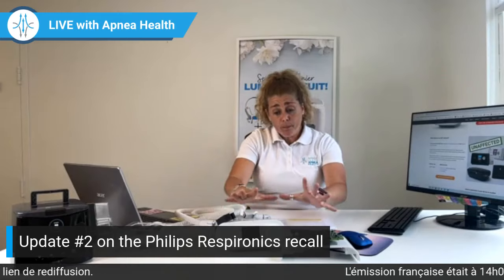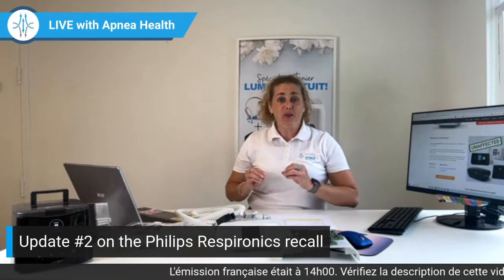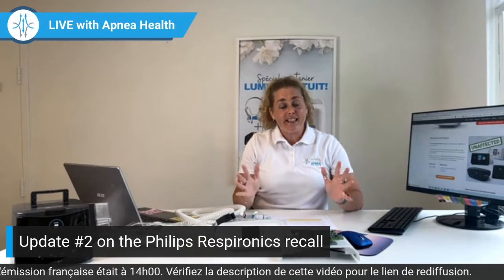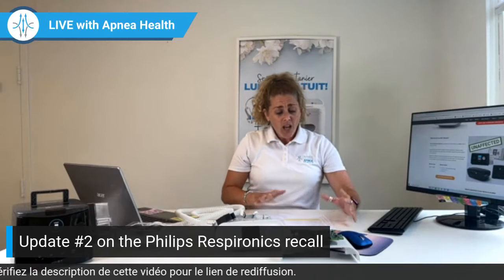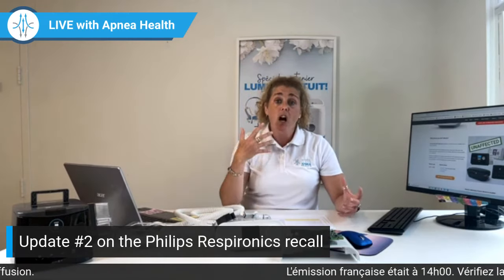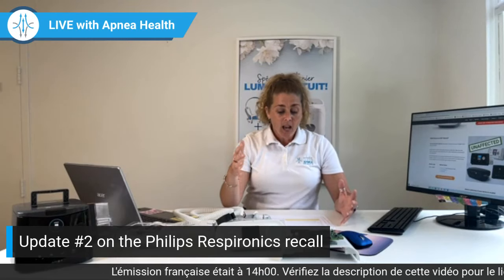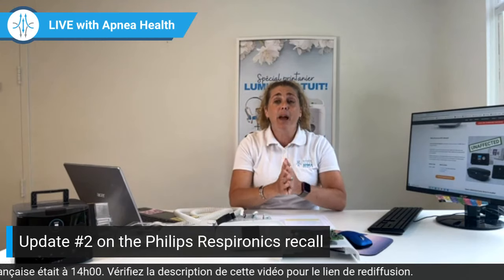Okay, so don't take apart your CPAP. Look at your tube, your mask, and your water chamber first, and then you'll see. So the risks are very low to find anything. Now, you may ask yourself, should I stop using my CPAP? And that's a question that a lot of you guys are asking right now. We're getting a lot of calls on that. And you're asking yourself, okay, should I stop using my CPAP?